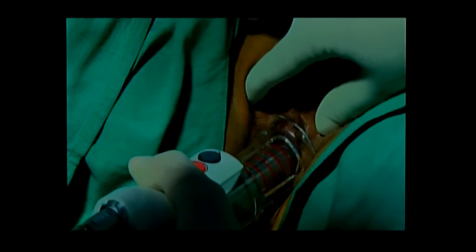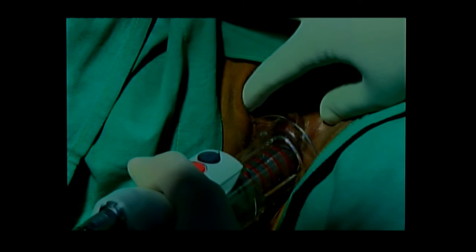Now because this one is for atrophic vaginitis, probably she'll need only 1 sitting, or maybe if it recurs, 1 more after a month. The other cases, for stress incontinence, follow the 0, 1 and 2 months schedule. Will the patient complain about recurrence, or will you examine her? No, obviously we'll do a per speculum exam. This one has been coming to me for 1 year with chronic itching. So I'm hoping that she'll not come to me again.